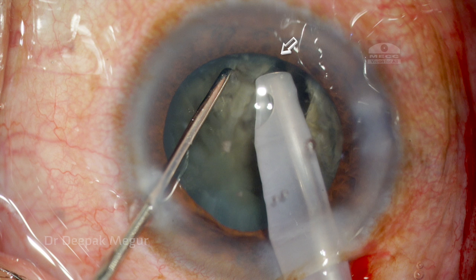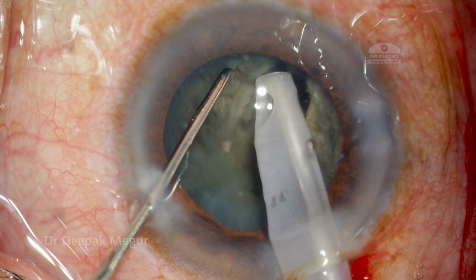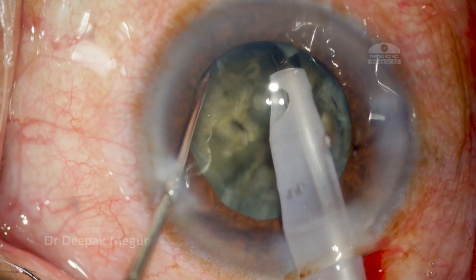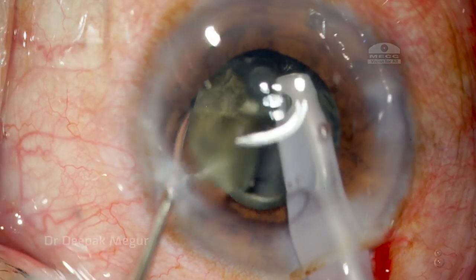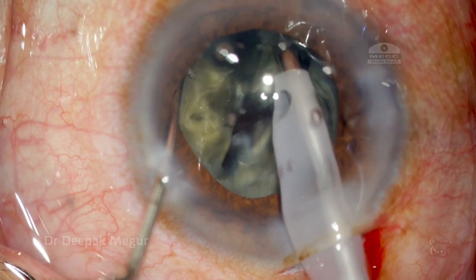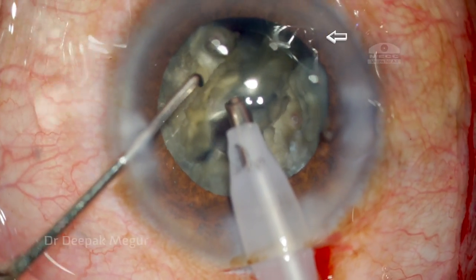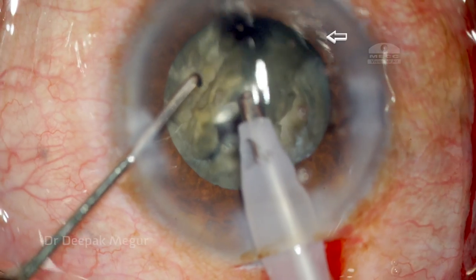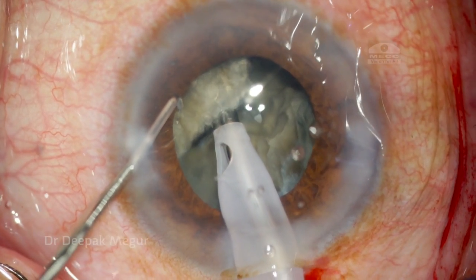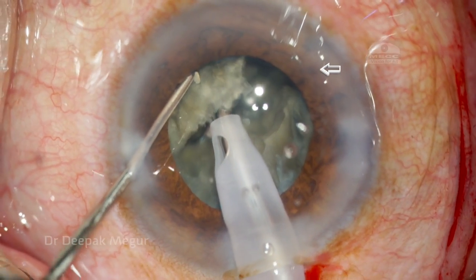This is the step where I believe the PC tear actually happened. The feco tip is far too peripheral for my liking, and this is when it probably would have occurred. We can notice that the fragment is lying horizontal at this stage, which is very unusual in this situation. I continue with chopping the next fragment.